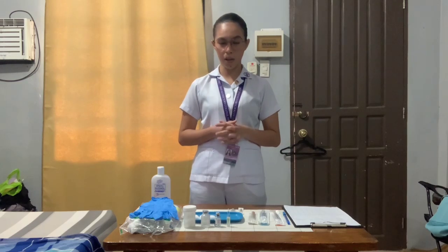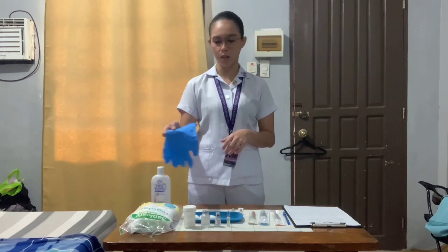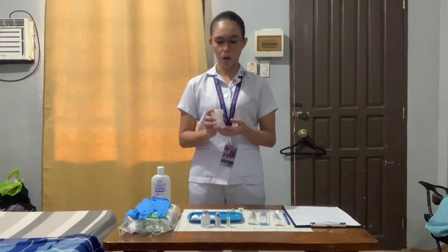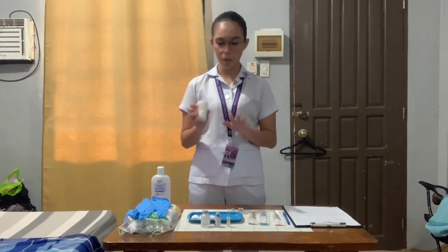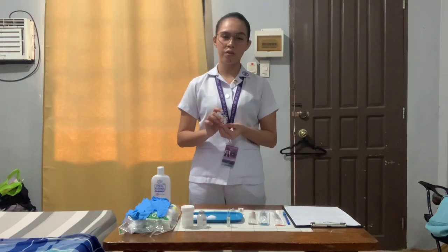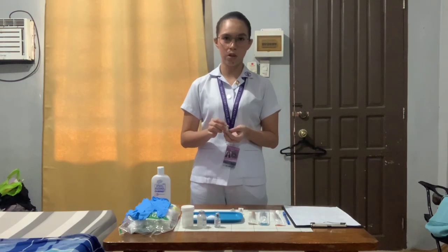So now I'm going to organize the equipment that we need to use in this procedure. We have here a clean pair of gloves. We also have our cotton balls here in case we run out of cotton balls later. I also have here cotton balls soaked in 70% alcohol. I have here my sterile water to use as my medication. And I have here my vial as a medication for the intradermal route. And then I have here my ampule for the intramuscular route.